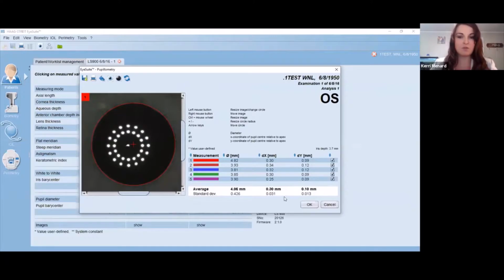So it can be a quick tool for your surgeons to look at these coordinates to say, is my patient a multifocal lens candidate, or is their visual axis a bit too deviated from central, and they may have more complaints after a multifocal lens if we utilize one.